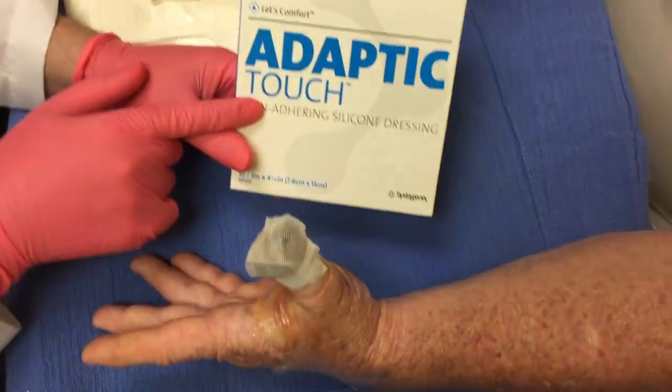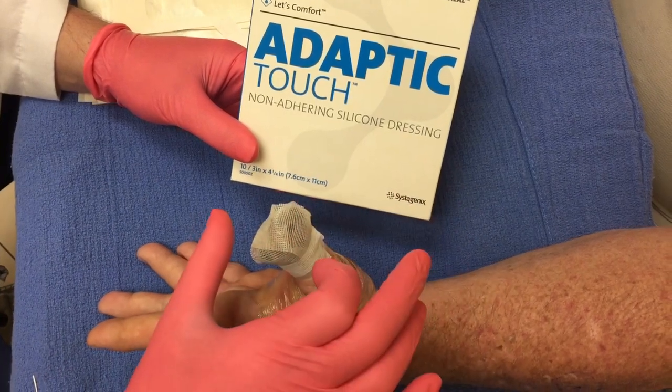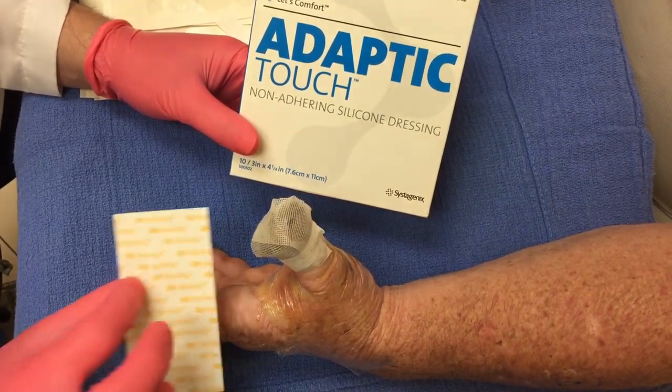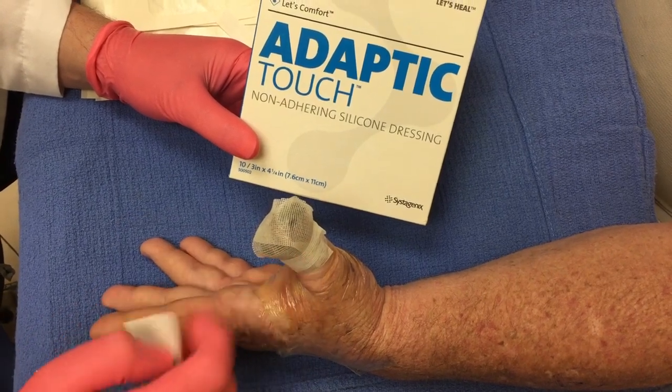I used the Adaptic Touch — it's silicone. I cut it in half, put it both directions, and then secured it here with the half-inch Steri-Strips around the base.